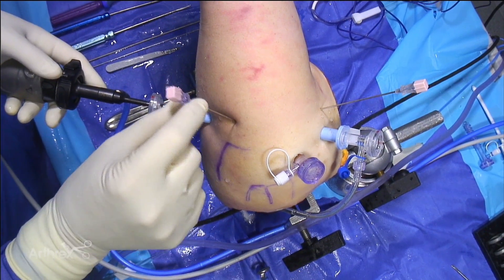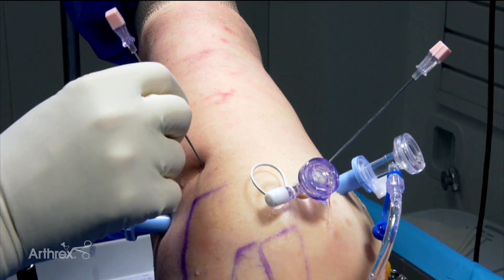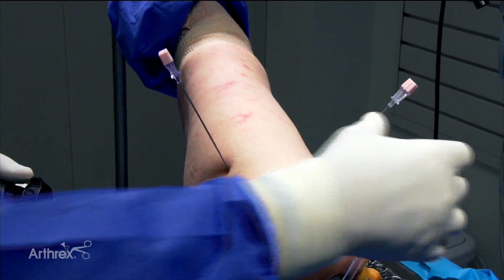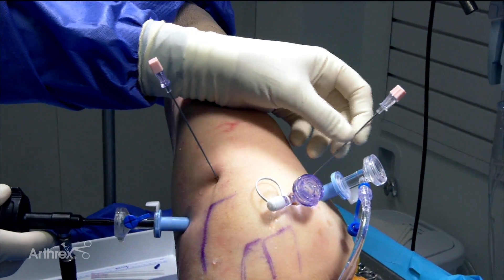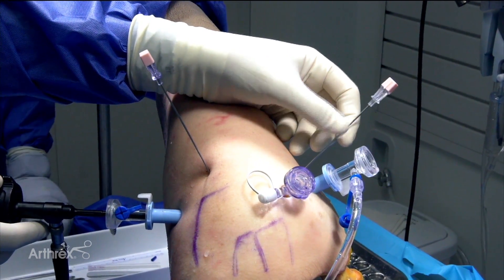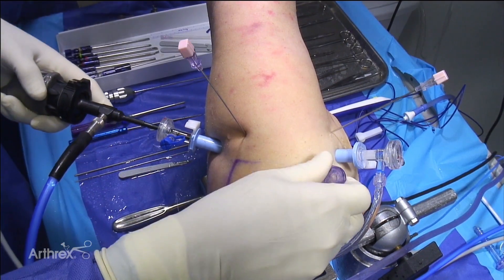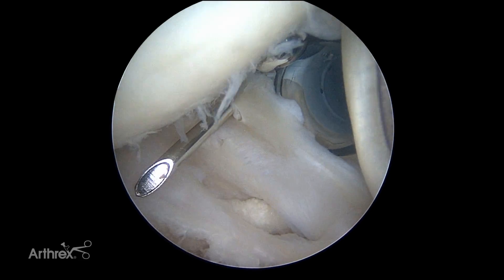Left shoulder, and I have a couple of spinal needles pre-placed. This is the posterolateral portal for placing an anchor even down towards six o'clock — the angle of approach is much better for anchors than the standard posterior portal. This is our five o'clock portal — on a left shoulder it's not literally at five o'clock on the face of the clock, but that's what Jim Toboni called it — it goes through the subscap as a trans-subscap portal for a better angle of approach down to the anterior inferior part. This is our anterosuperolateral portal, posterior to our biceps.